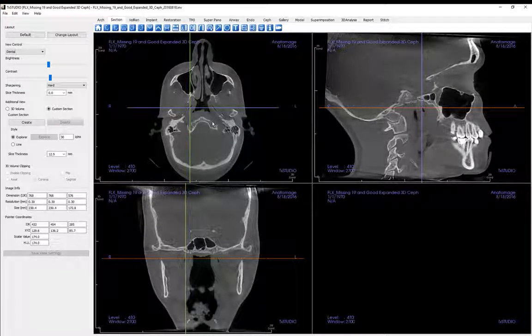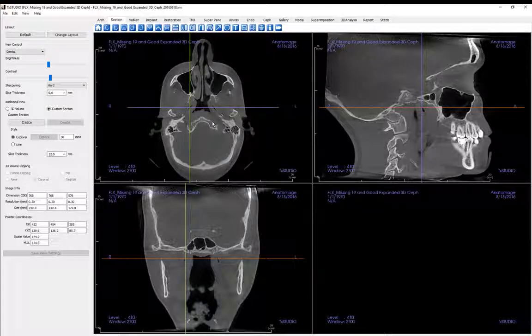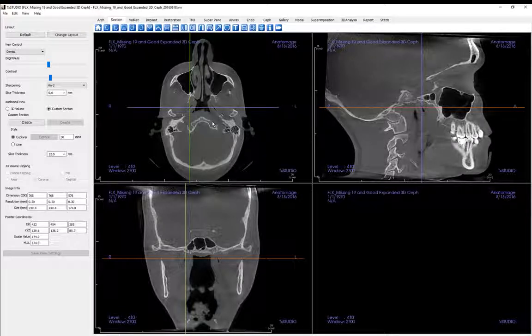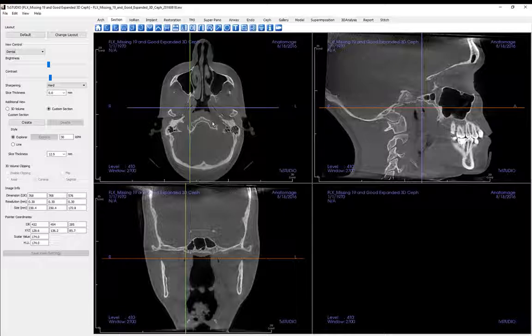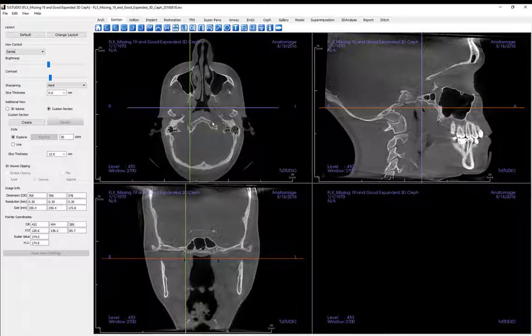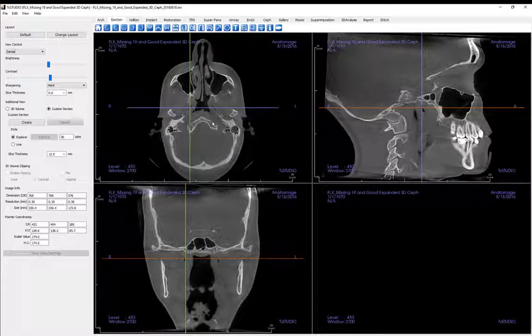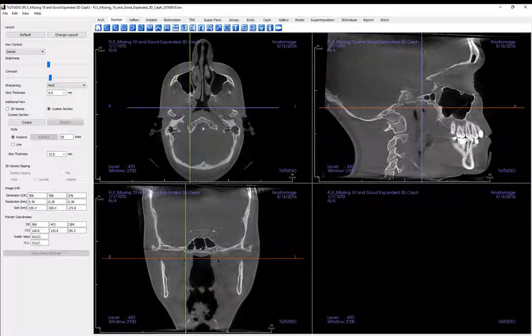Secondly, you may also grab one of the cursor lines by left mouse clicking on it and while holding down the mouse's left button, move the mouse until you arrive at the desired location within the corresponding orthogonal image.